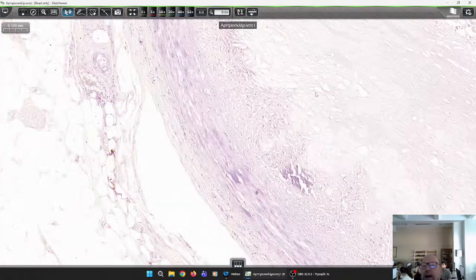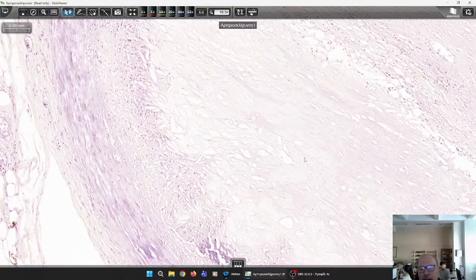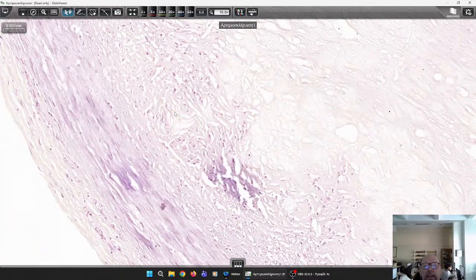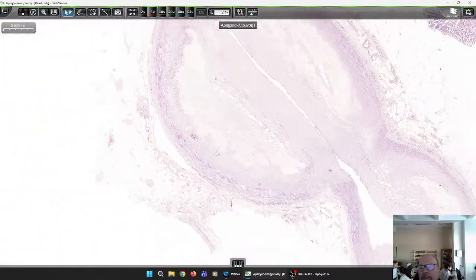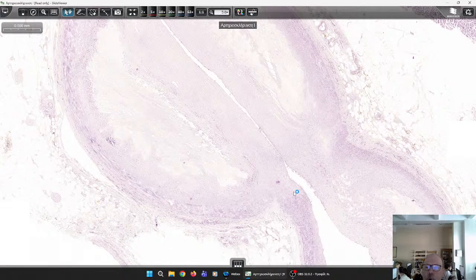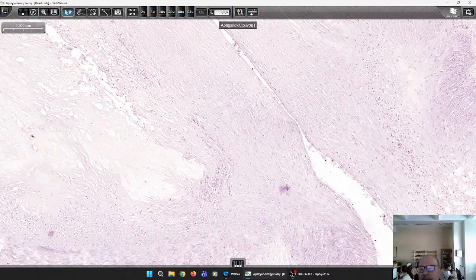So here is the fibrous tissue, increasing the size of the atheromatous plaque, the cholesterol clefts, needle-shaped, and the macrophage. So what happens? This is the place where the inner layer of normal thickness transmits to the thickened inner layer due to the atheromatous plaque. So when the blood presses this area, it causes erosions.